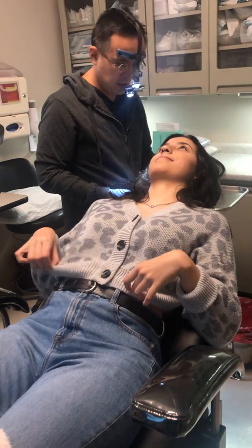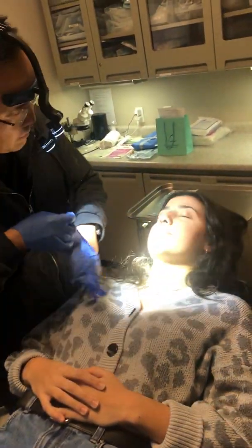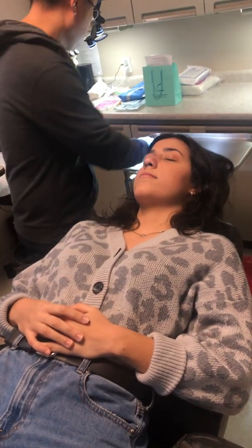Are you using salt water or saline in the nose? Yeah. Okay, good. Just keep doing that. Close your eyes, very bright light. Okay, I'm going to use a little speculum.